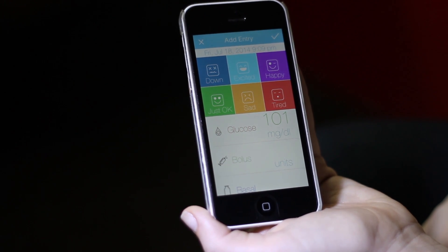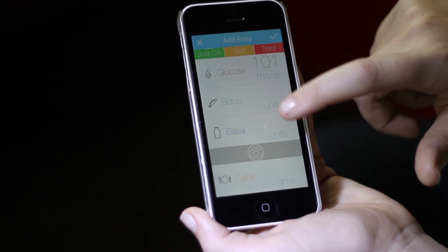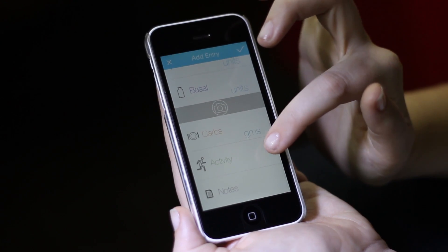So my reading has come in, my mood is excited. There's also a section to put in my bolus and basal if I'm taking a shot.